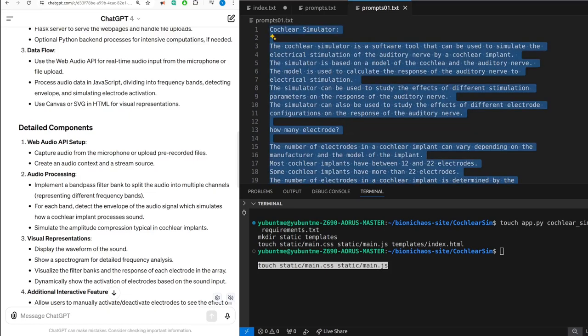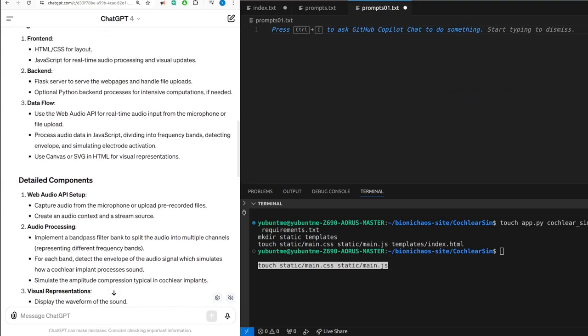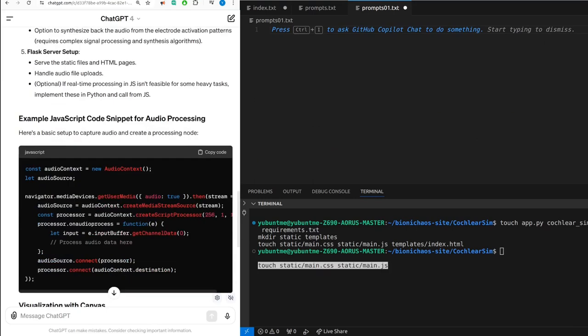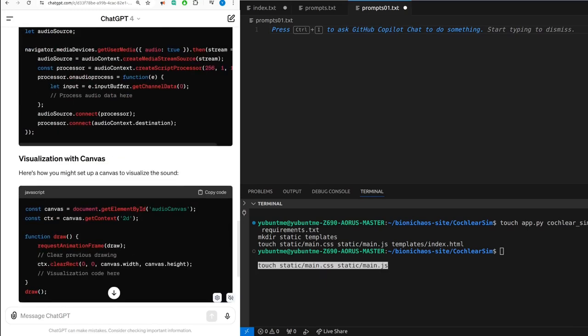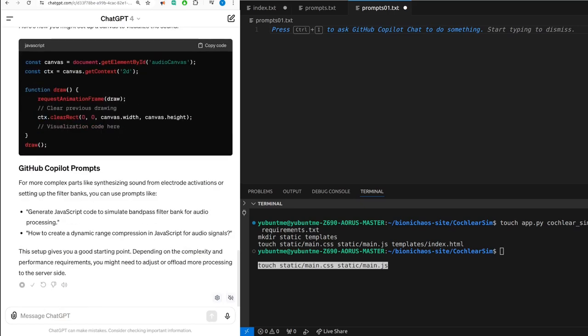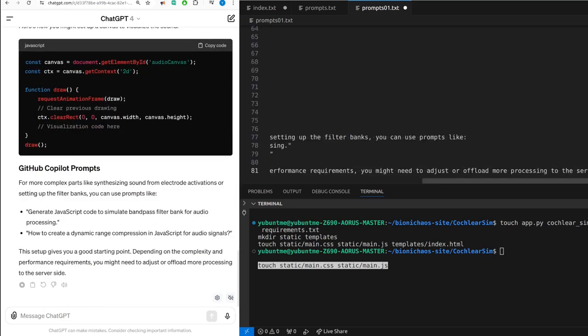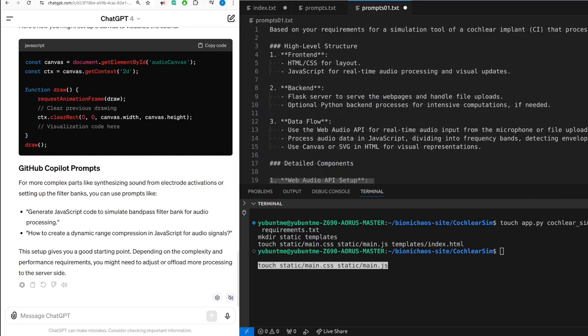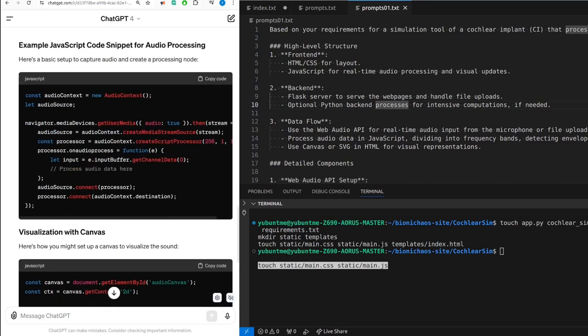Here's a basic setup to capture audio and create a processing node. JavaScript: const audioContext = new AudioContext(); let audioSource = navigator.mediaDevices.getUserMedia({audio: true}); then stream, audioSource = audioContext.createMediaStreamSource(stream). const processor = audioContext.createScriptProcessor(256, 1, 1). processor.onaudioprocess = function(e) { let input = e.inputBuffer.getChannelData(0); // Process audio data here }. audioSource.connect(processor); processor.connect(audioContext.destination). Here, visualization with canvas.